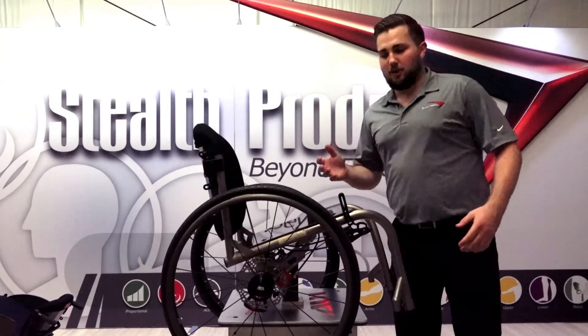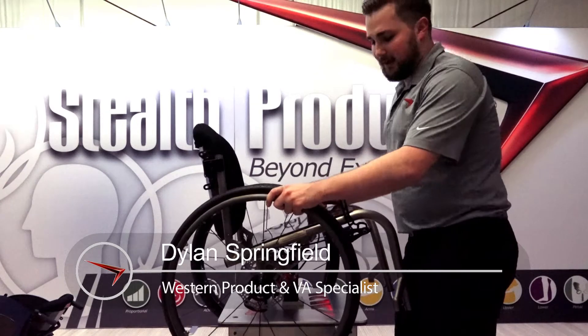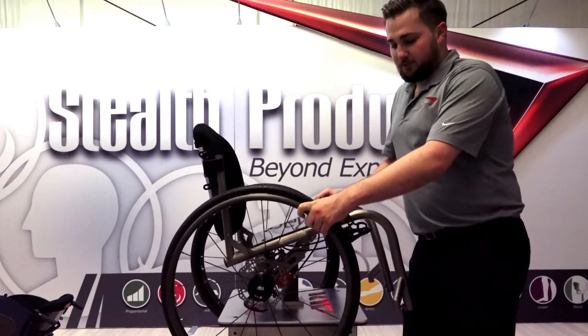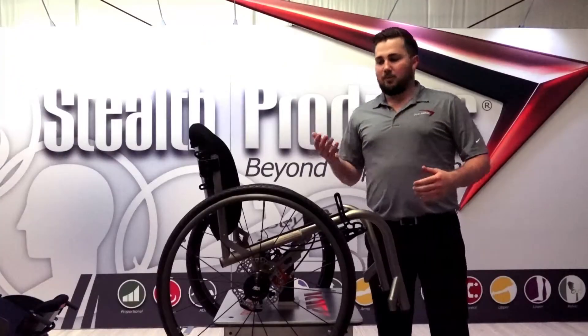Hey guys, Dylan here with your weekly product update. I'm really excited about this week's product — the ADI disc brake system. It's a Medicare-coded disc brake true braking system for manual chairs in the manual mobility industry.